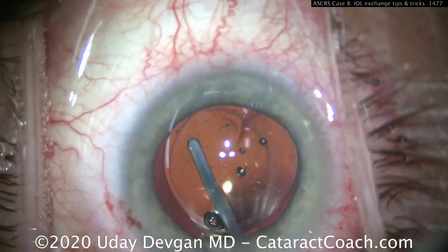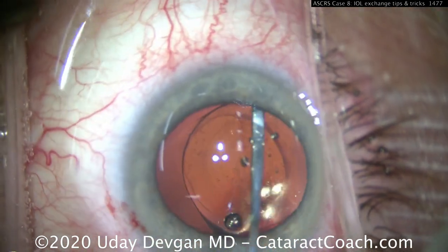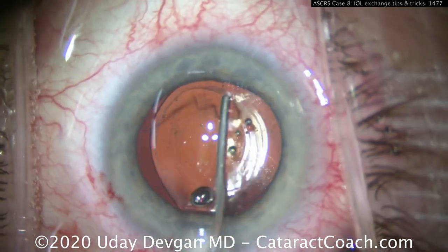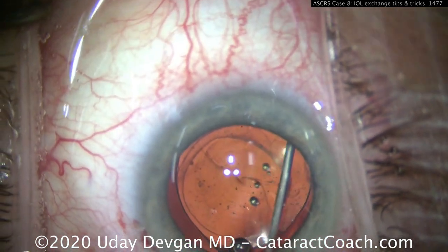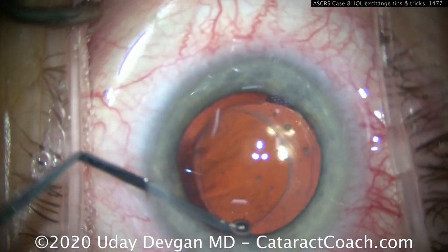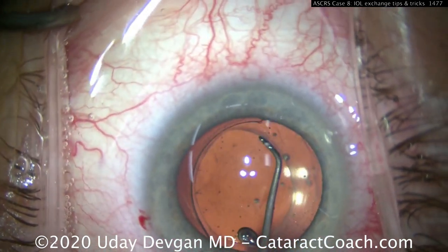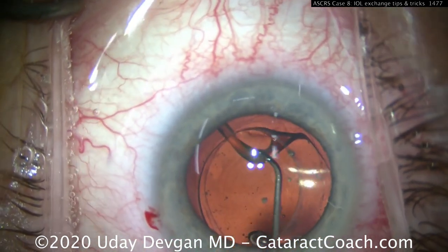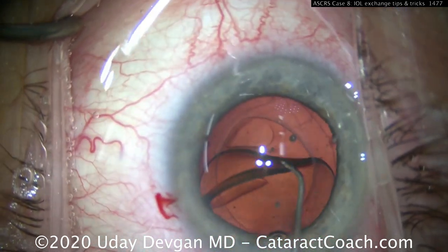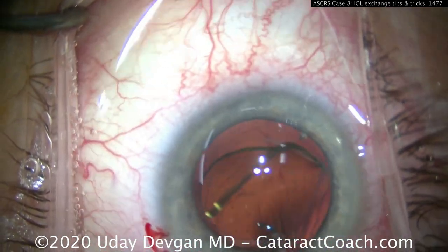Switching to a blunt spatula to help separate the lens and create more room. Once that's done, inject viscoelastic with the blunt cannula — there's the viscoelastic wave going behind the optic, which helps free it up. You have to separate the anterior and posterior leaflets of the capsular bag to free the haptic; one haptic is freed fairly easily, then we bring the lens up and free the other.